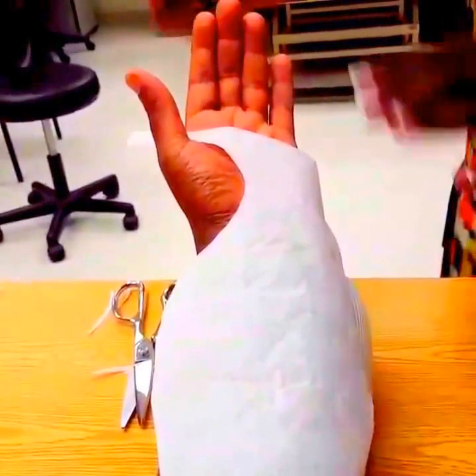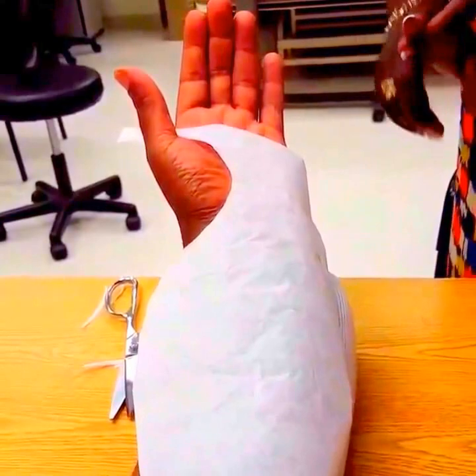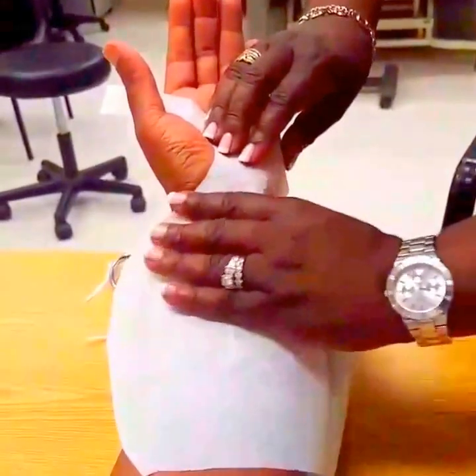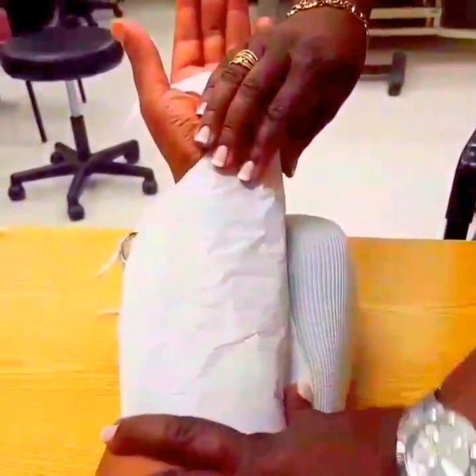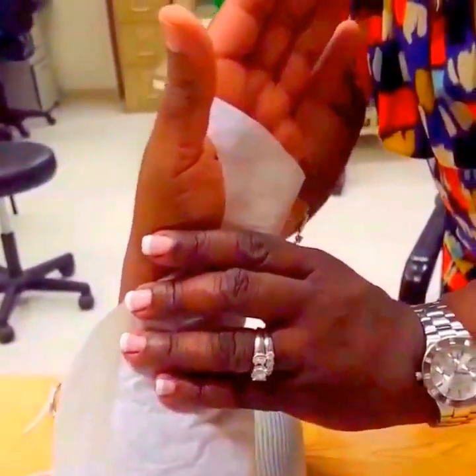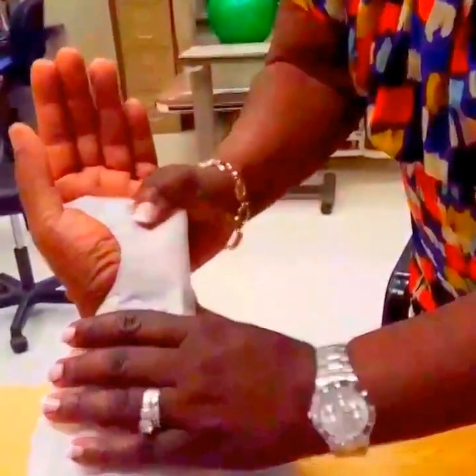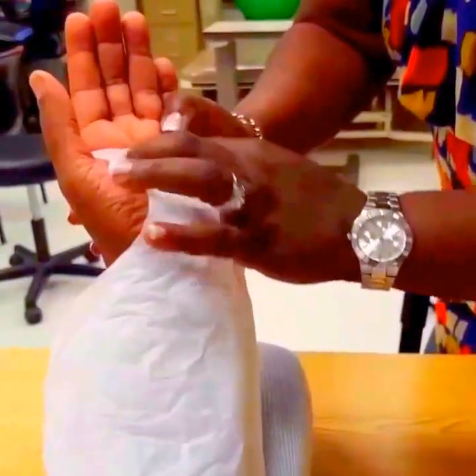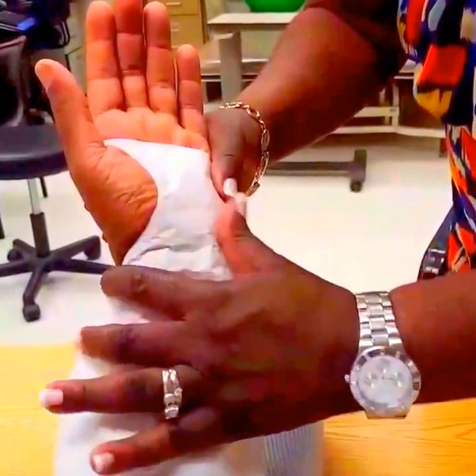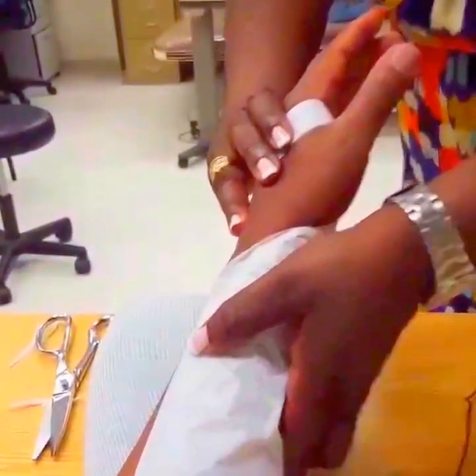Now that you have your pattern, remember the purpose of your pattern is so you will measure twice and cut once. You want to make sure your pattern is fitting nicely — that it's two-thirds the length of the forearm, the C-bar or palmar bar does not extend past the second digit, the top of the splint is resting at the distal palmar crease, you have the thenar eminence nicely cleared, and it goes up at least half or midway the width of the forearm.